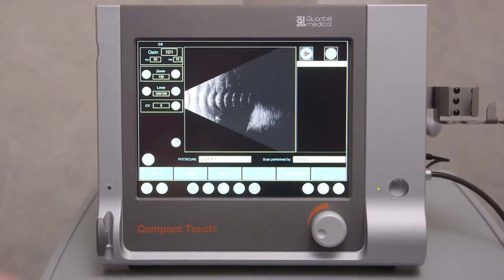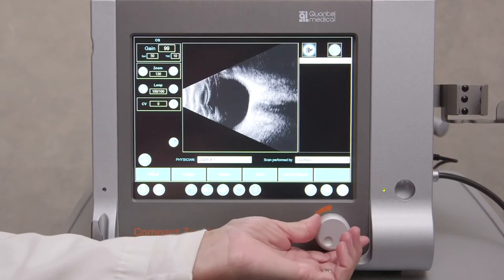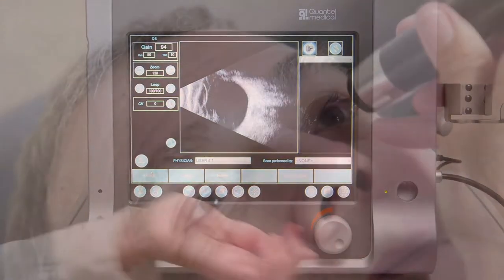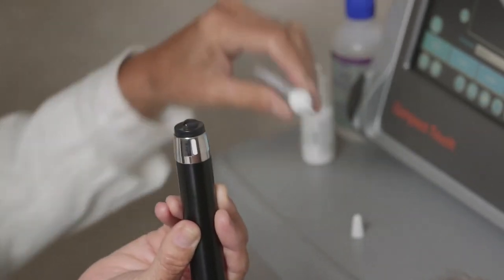An axial scan directs the sound beam from front to back, allowing imaging of the lens and optic nerve. The patient should be looking in primary gaze as the probe is placed gently on the cornea. Use copious amounts of gel to cushion the face of the probe on the cornea, and avoid moving the probe too much to limit the risk of corneal abrasion.